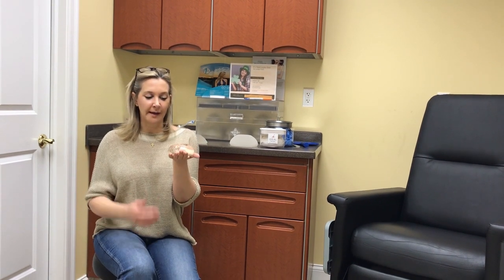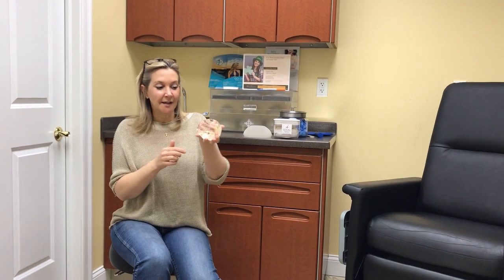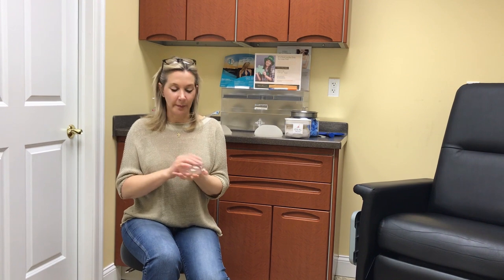And by optimally filled, what we mean is that the balance between how it feels and how soft it is, to approximate how your breast feels, is balanced. If we overfill it, it would feel too firm. But if we underfill it, you see the wrinkles that are in the side, you may be able to see those through your skin. So through the years and generations of silicone implants, they've come with this optimal fill that balances those situations.